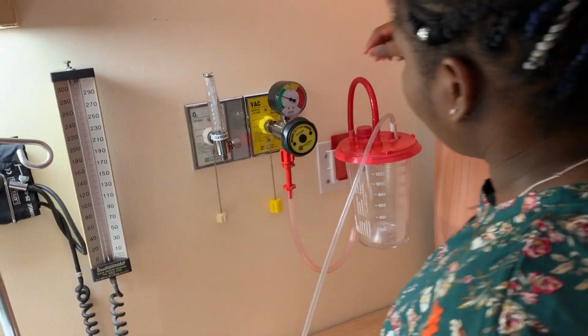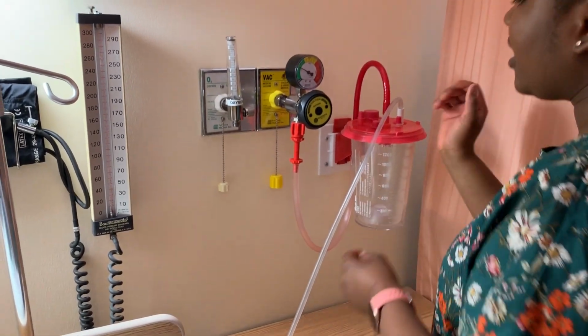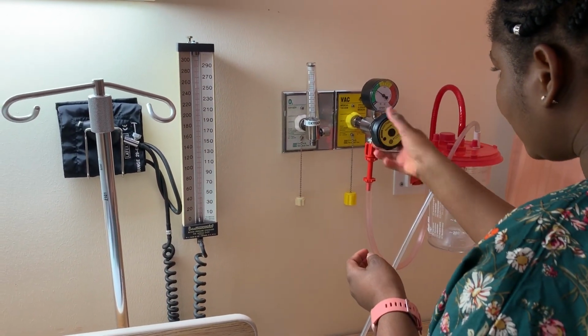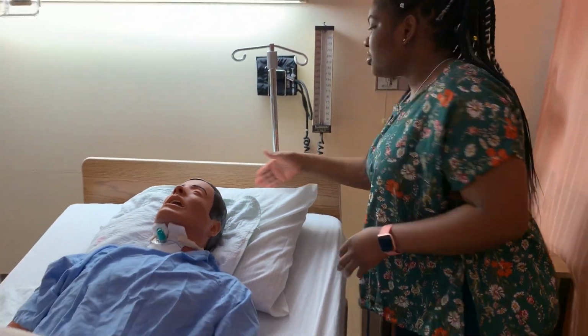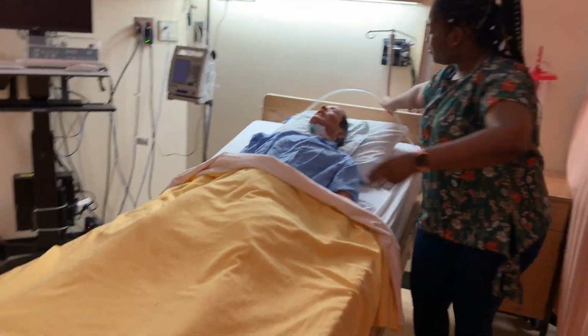I have all my connections connected. I'll have to make sure that my suction is in the low. So yes, it's in the low, it's in the green area, so that's low. So I'm gonna follow the tube in. So I'm gonna do that now before I end this video.